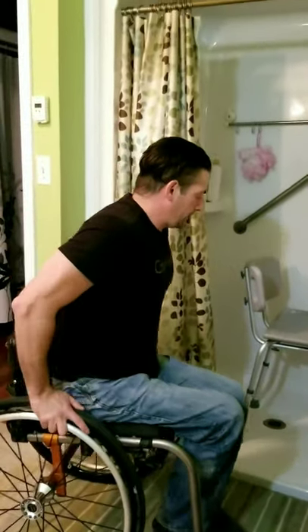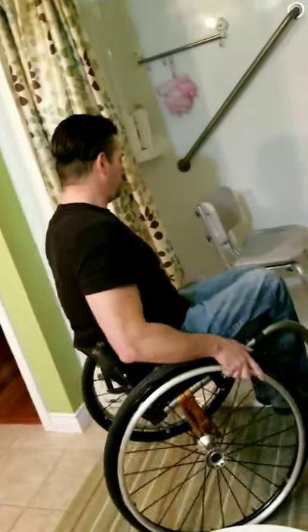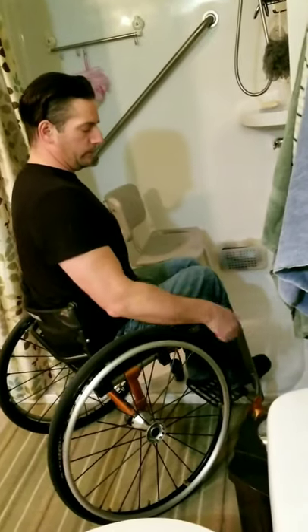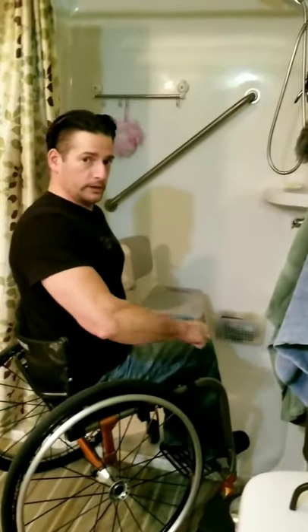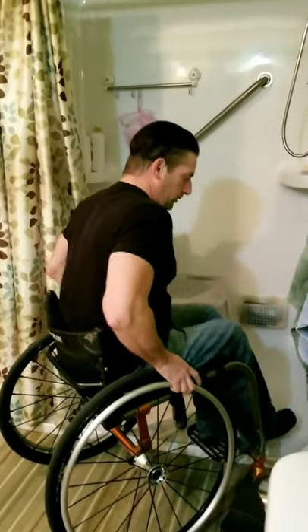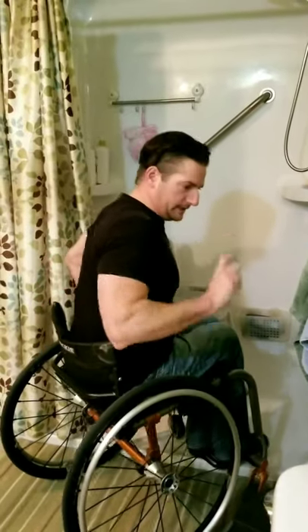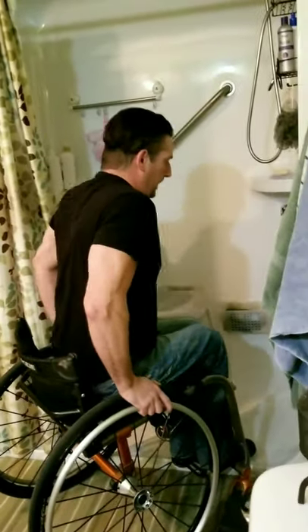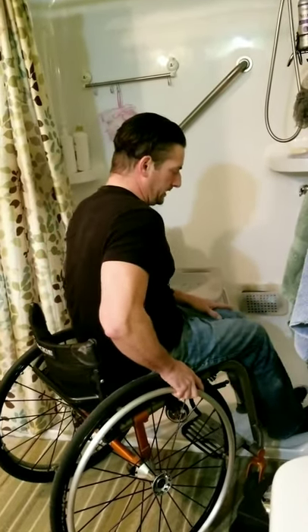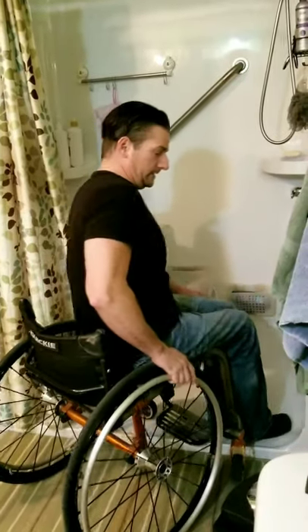What I'll do is pop my left caster wheel up into the shower. I won't use my brakes or anything because I like having the free range of my chair to angle it properly. It's just an inch and a half — I won't tip backwards or to the side. Then I scoot my butt up to the edge of the chair and place my feet inside the shower, which helps with momentum to get onto the bench a little bit easier.